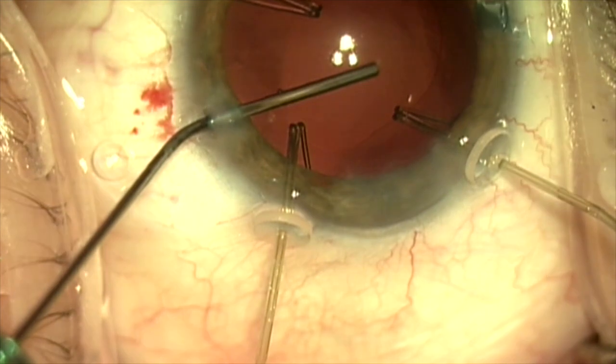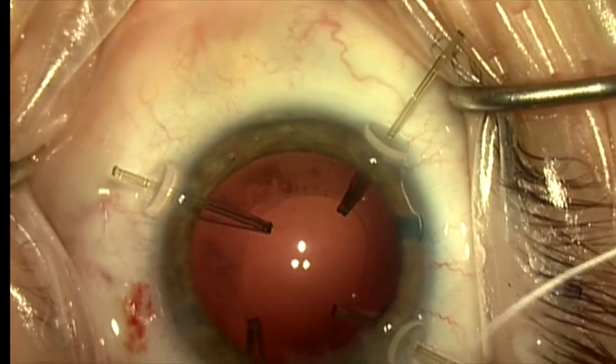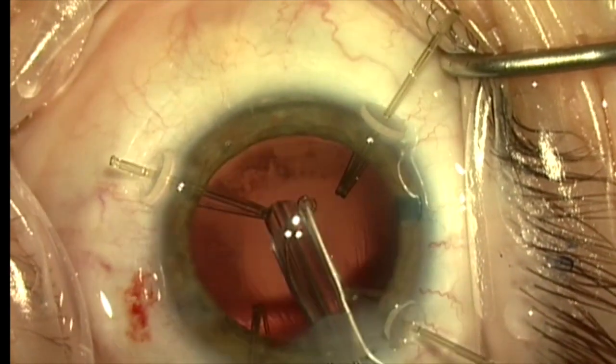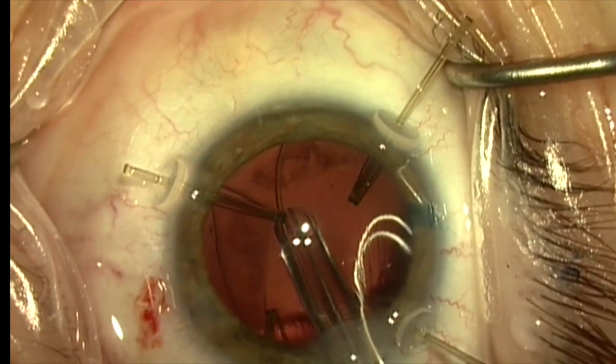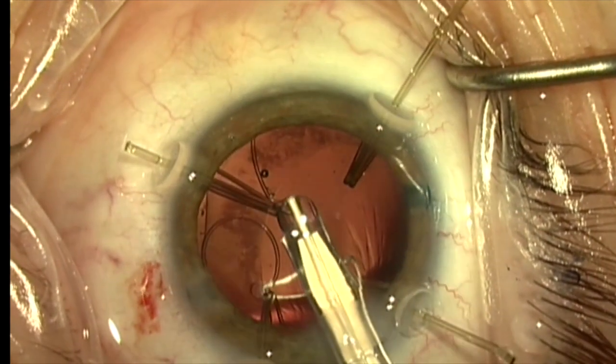Once this is completed, we're going to fill the capsule bag with cohesive viscoelastic. I'm now going to use a Cionni-modified capsule tension ring. A Gore-Tex suture has been passed through the eyelet, and I'm going to go ahead and inject this into the capsule bag.